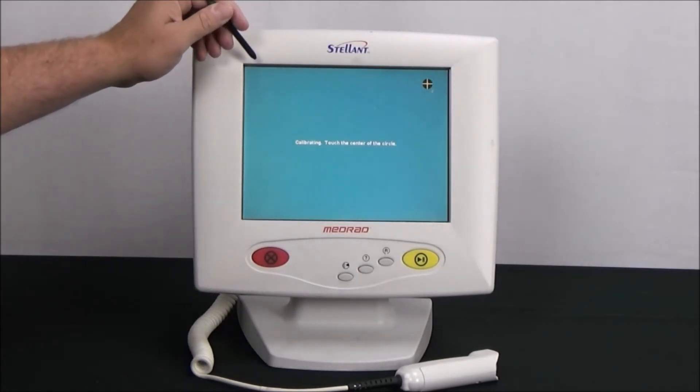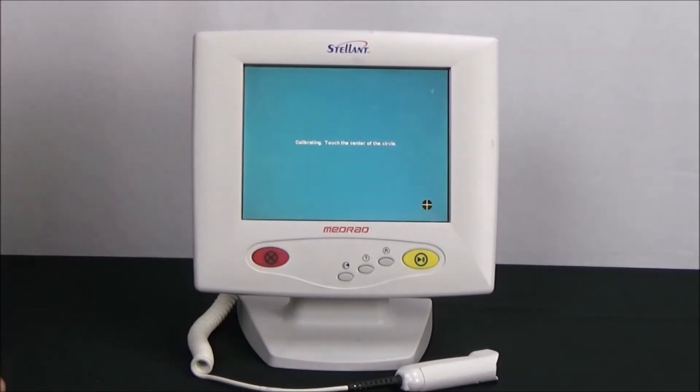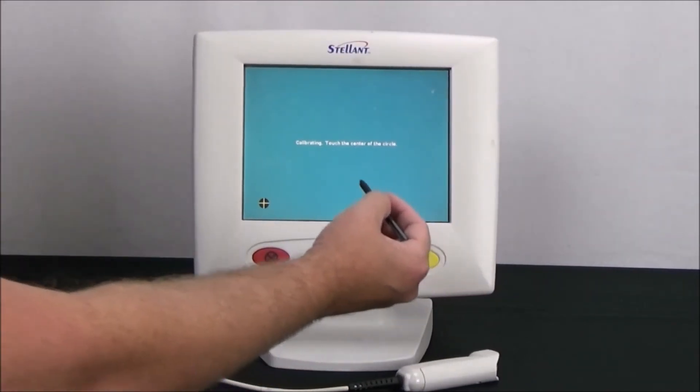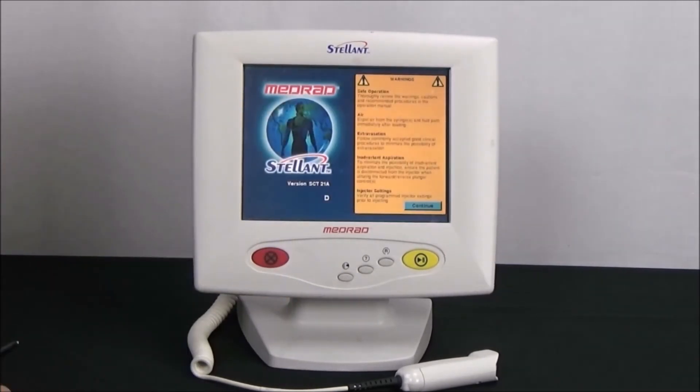A screen will appear with instructions to press the appropriate targets in order. Once all four targets have been touched, it takes us back to the safety screen.